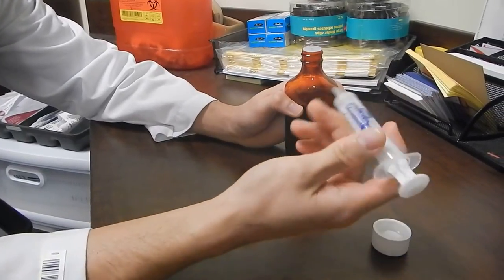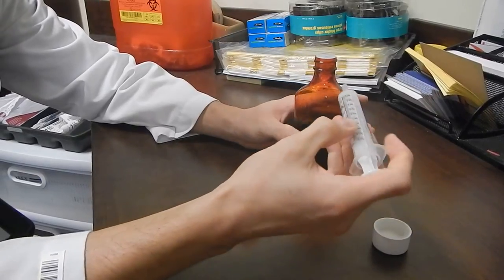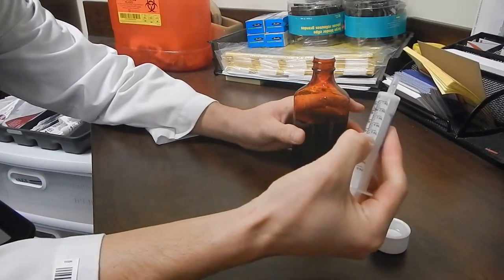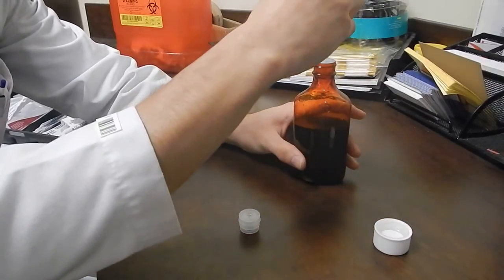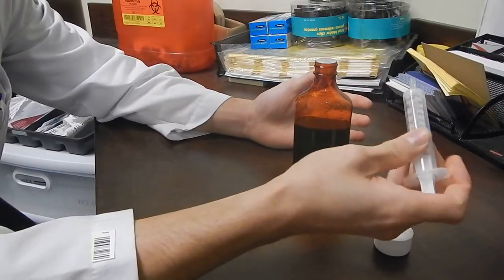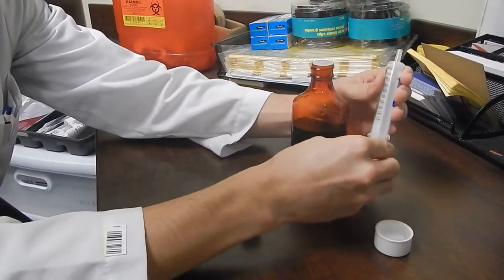And once that's in, to measure out the dosage you need, let's say for example you needed five milliliters, first make sure the syringe is pushed all the way to the top.